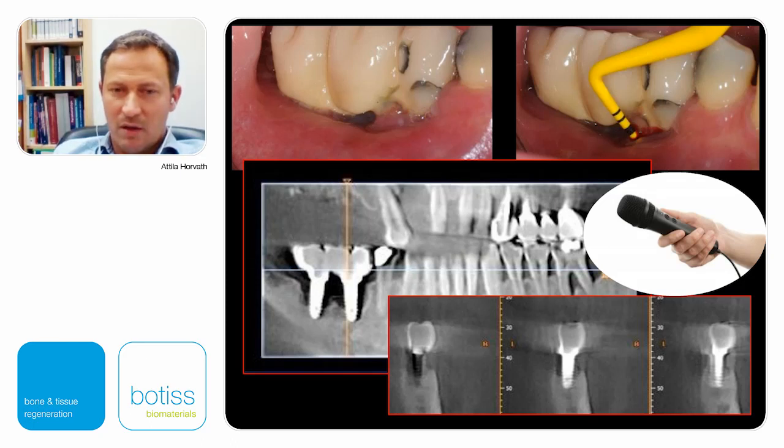Let's wait for the healing. Inflammation is gone. Then do a proper bone augmentation, proper GBR, then most probably a proper soft tissue grafting, because you don't have any keratinized tissue. And afterwards, we can place 2 implants, and afterwards, a prosthesis. Which means, I would say, a year and a half, easily. The patient was very kind, he said he understands my point, but he doesn't want to let these implants be explanted.